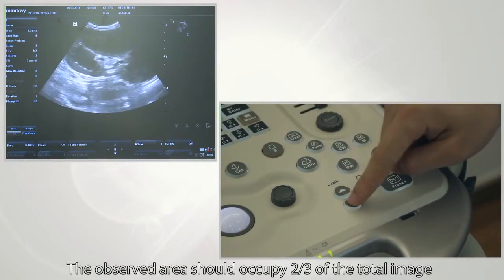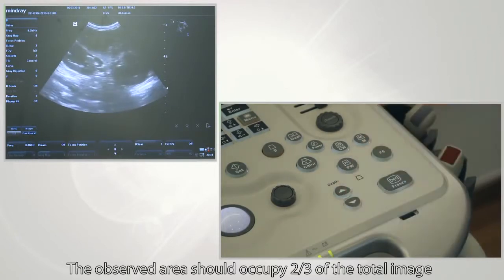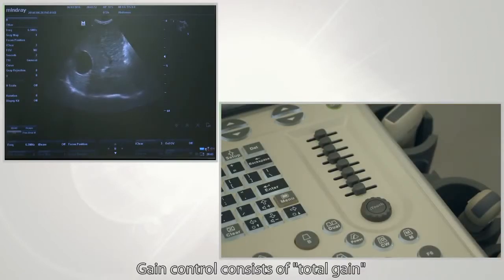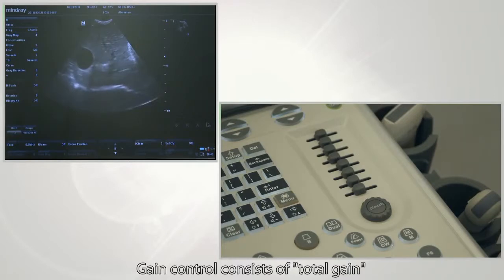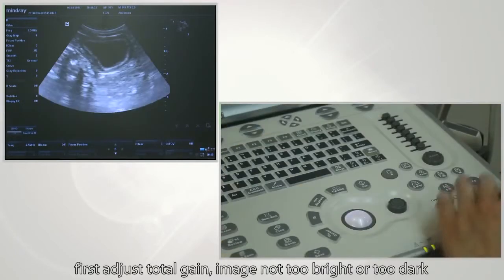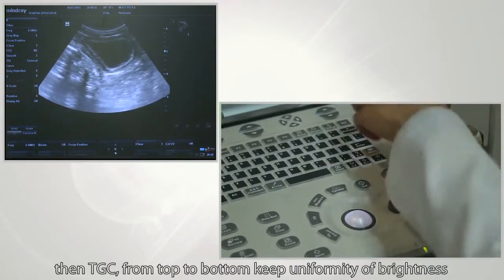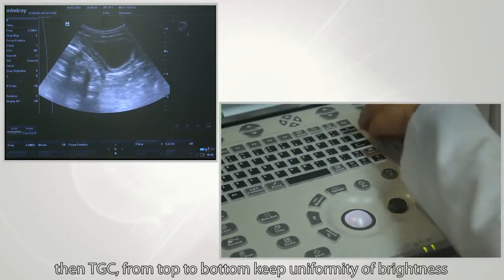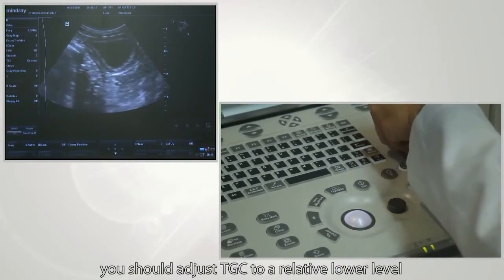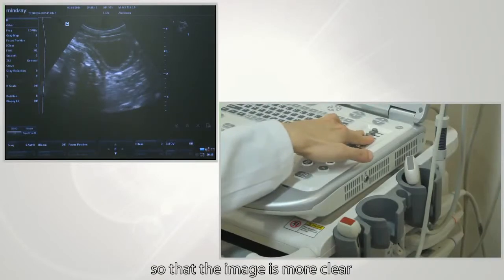The observed area should occupy two-thirds of the total image. Gain control consists of total gain and TGC, which means time gain compensation. First adjust total gain to make sure the image is not too bright or too dark, then adjust TGC from top to bottom to keep uniformity of brightness. Below a fluid echo area, adjust TGC to a relatively lower level so that the image is clearer.